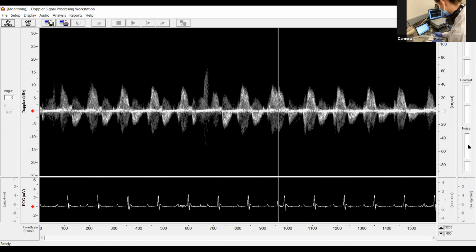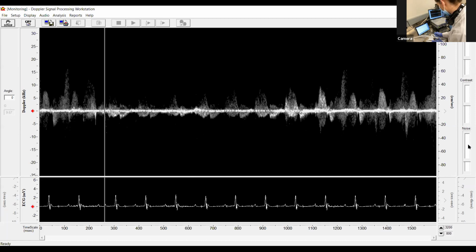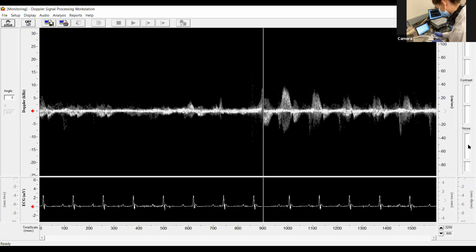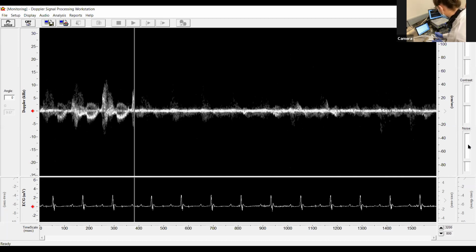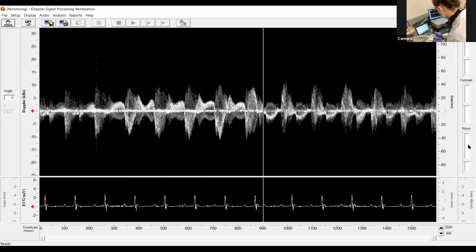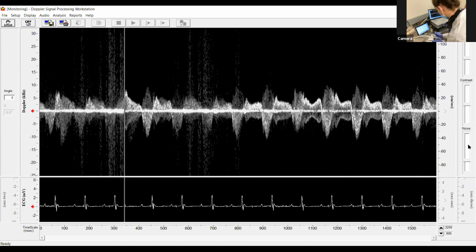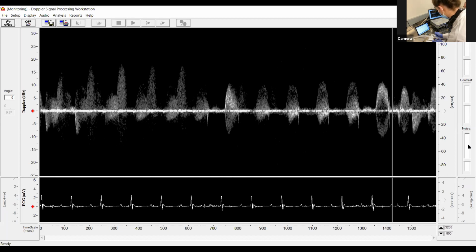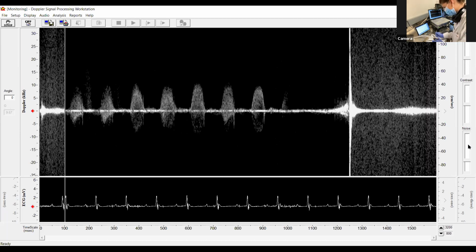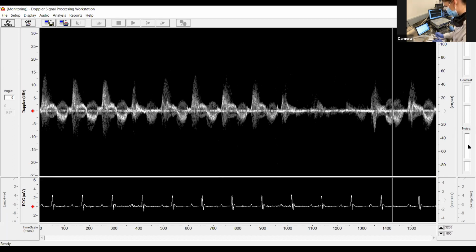So we should be looking for a nice, strong negative signal for the mitral valve flow from here, yeah? Yep. It's interesting. You're still seeing a lower E peak than the A peak.